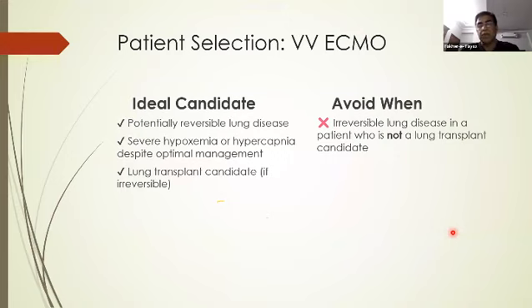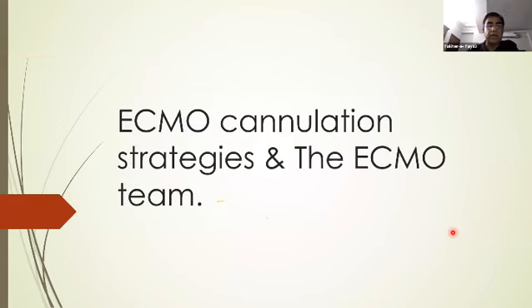See, when we talk about putting the patient on ECMO, it has got a lot of financial burden. It's not only a financial burden, but it causes a burden on the human resource as well. Your ICU bed gets committed. Usually we place one nurse per patient, but for an ECMO patient, you need to have two nurses in each shift for one patient. So it has a lot of implications. It's not that easy to decide about it.